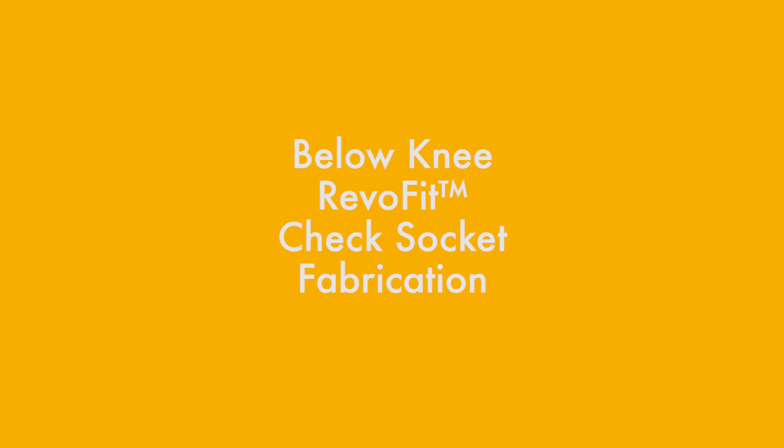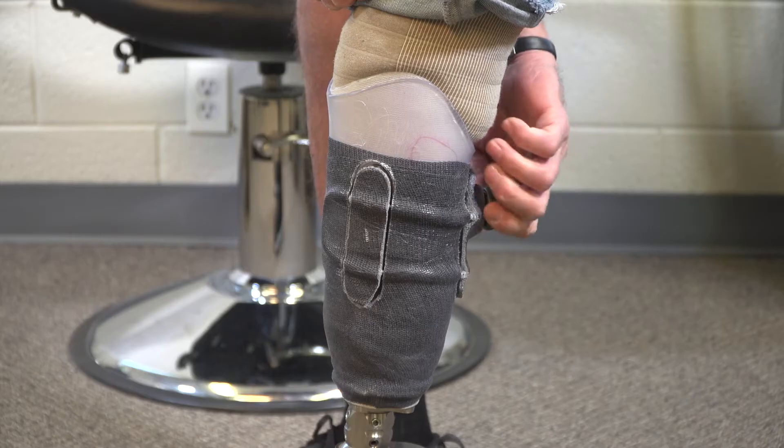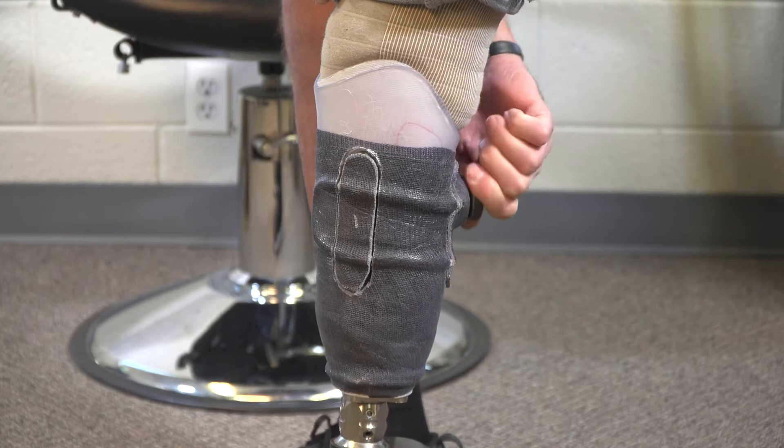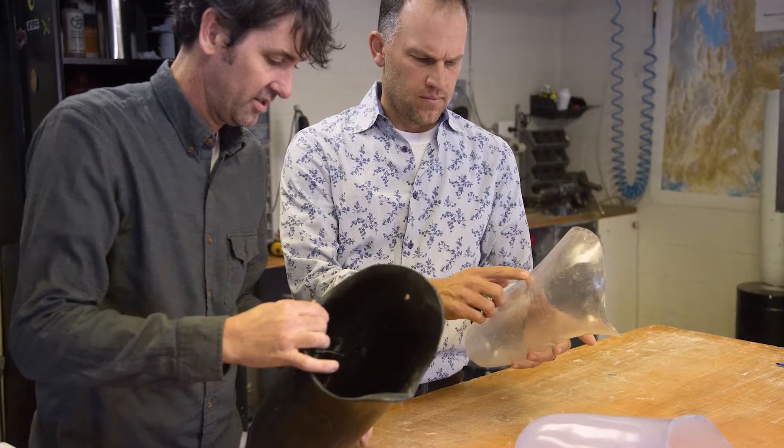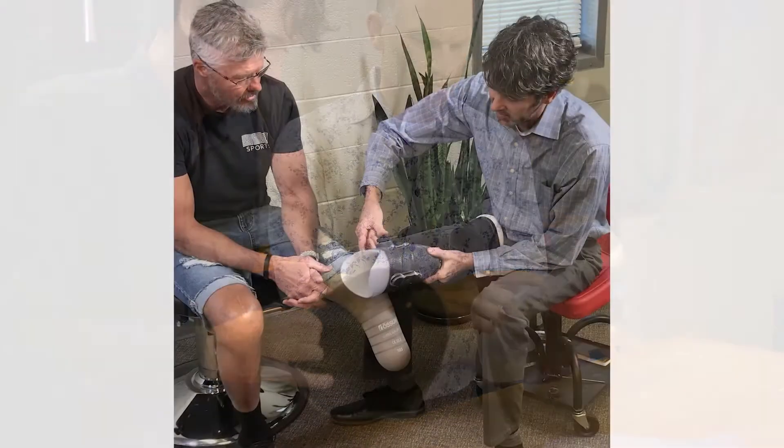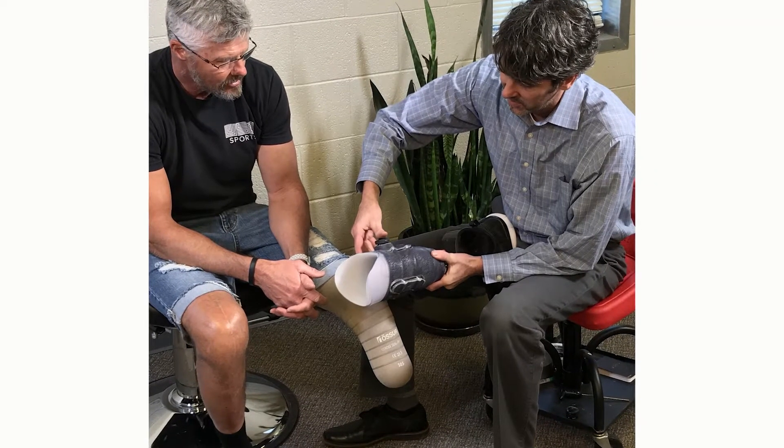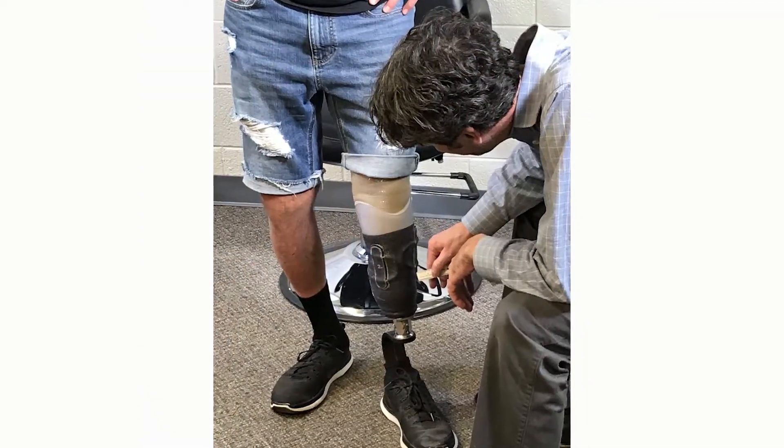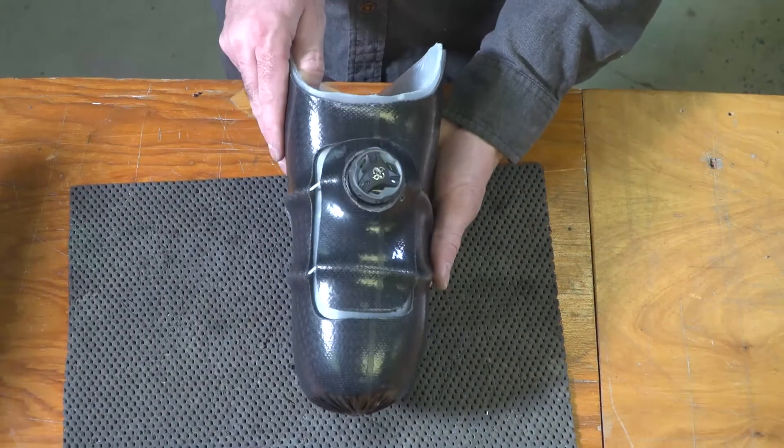Now that you've learned the design basics, let's build one. Start working with adjustability right from the very beginning, in the check socket phase. Integrating adjustability in the check socket gives you an advantage. Your patient can actively test the fit and function right there in your office, allowing you to make simple and easy adjustments to the design before committing to the definitive socket.